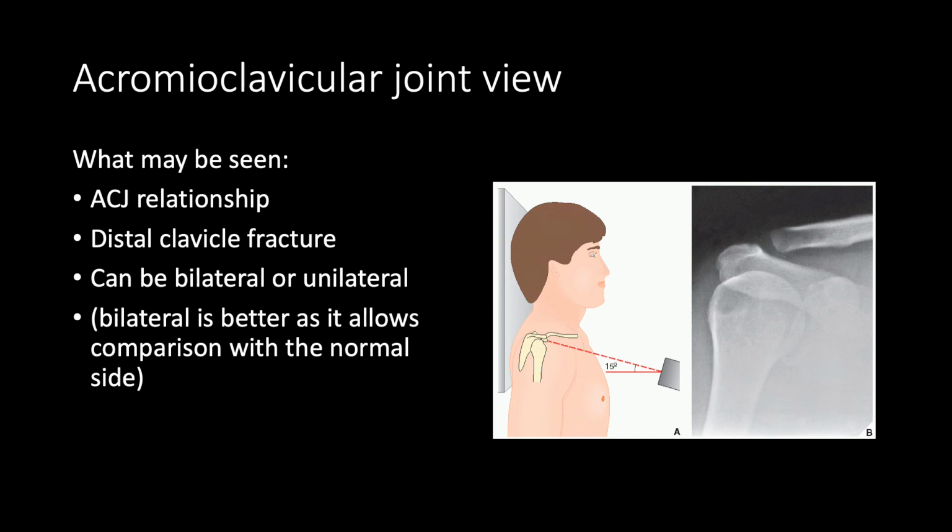And here you can see the beam shot up at about a 15 degree angle up through the shoulder joint with the film behind the patient here.